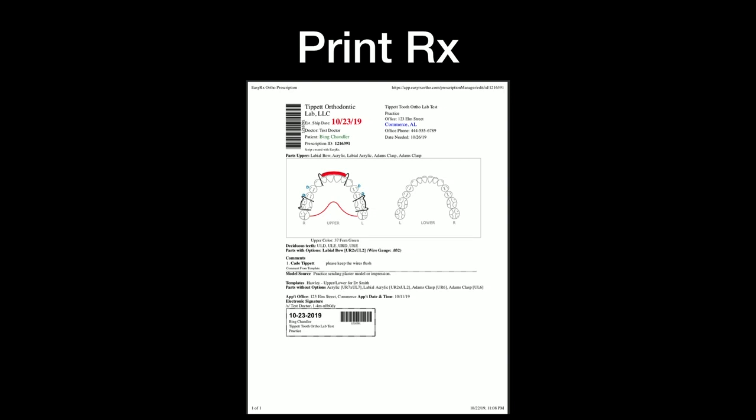So you print the EasyRx. This is how it comes out. You get a barcode you can scan, which is fun. So when you go to check out, you can scan everything, your whole list, and it starts checking them out. Done. Complete it. Starts building an invoice for you to bill the doctor with, and then give you shipping.